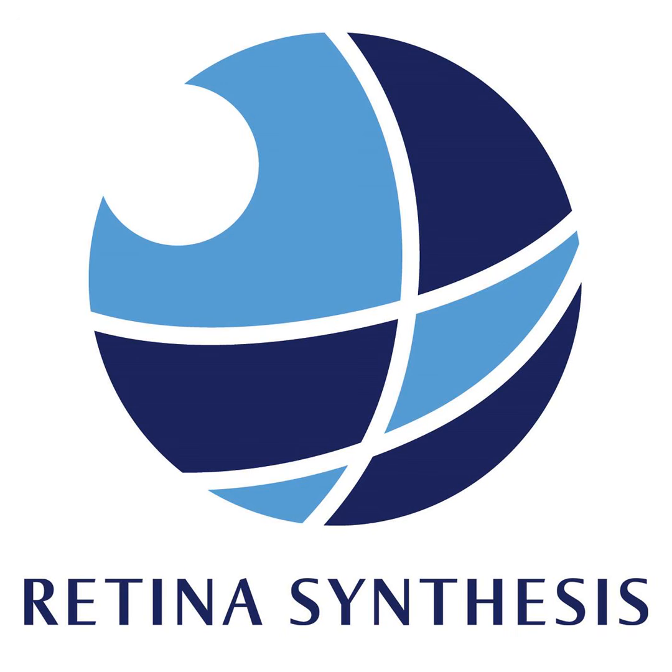So how would this system be deployed clinically? Well, that's a great question, because it could be a real paradigm shift for all of us. And I think I mentioned at Angiogenesis that the one thing you have to do as a physician is trust it. So if a patient is at home, they're scanning every day. Me, as the physician, I set parameters that say if the fluid gets to a certain level, I think they need to come in and get a shot. So they get an alarm. And I could go to the cloud and look at that OCT myself.